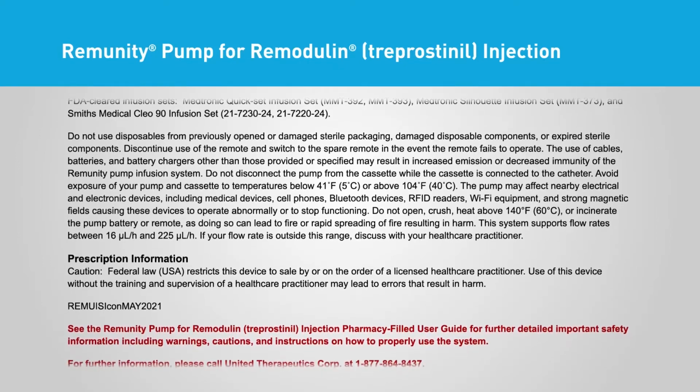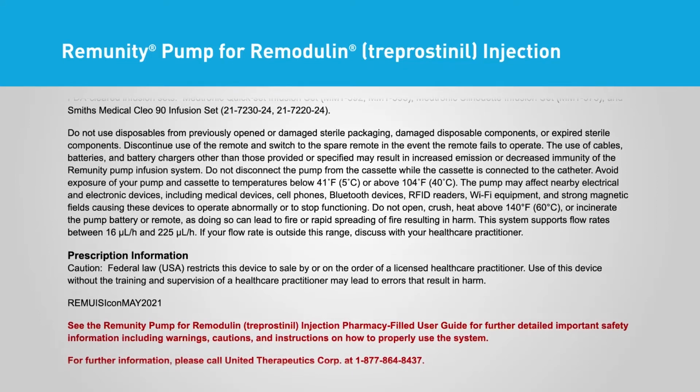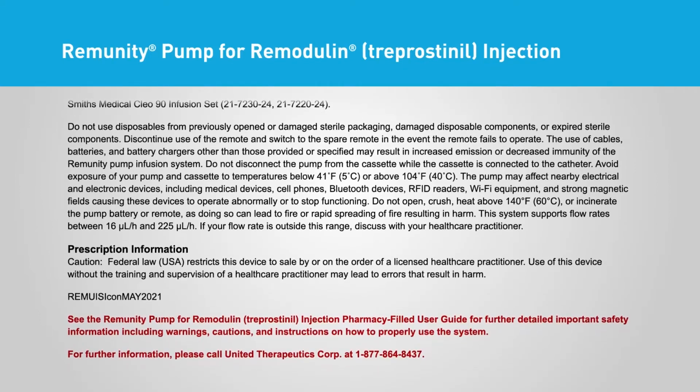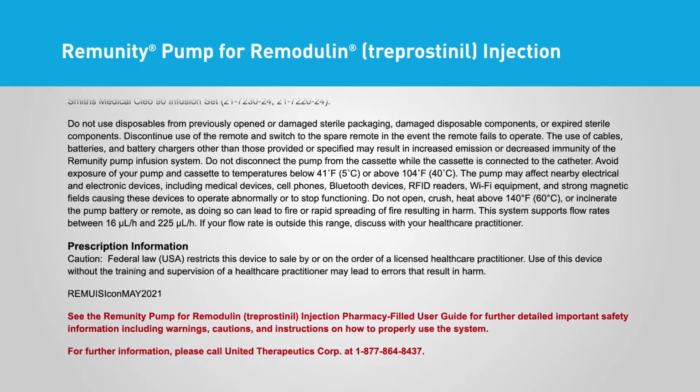This system supports flow rates between 16 microliters per hour and 225 microliters per hour. If your flow rate is outside this range, discuss with your healthcare practitioner.